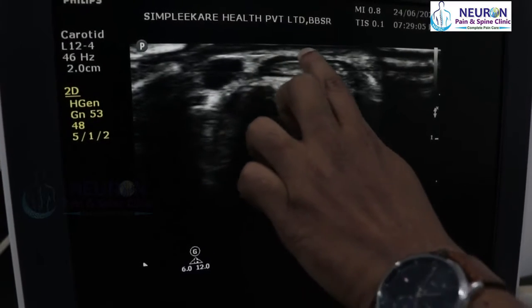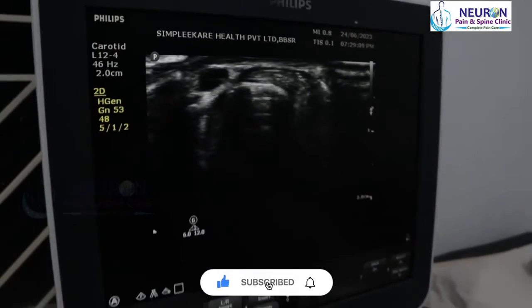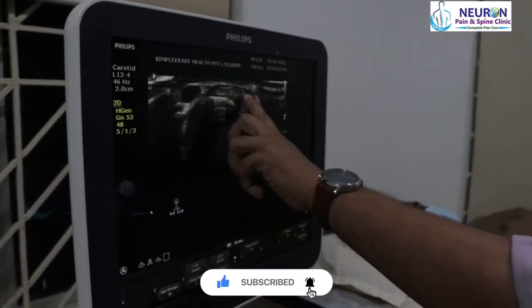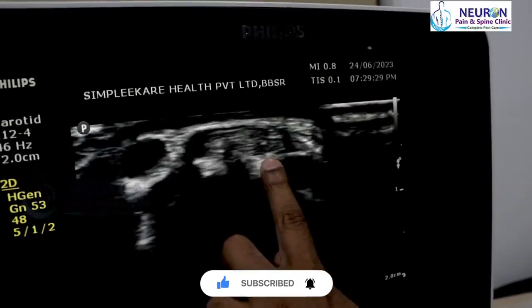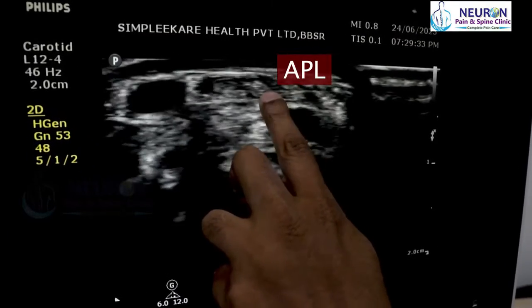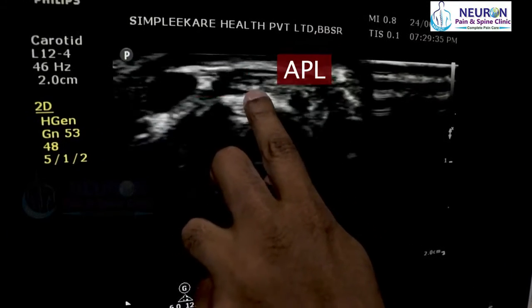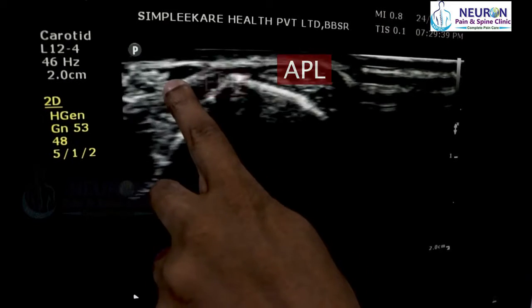The two tendons are very nicely separate and we can see the tendon sheath on top. Whenever there is de Quervain's tenosynovitis, that tendon sheath will be inflamed and there will be hypoechoic fluid around it. This is the first compartment — the bigger tendon is abductor pollicis longus and the smaller is extensor pollicis brevis.